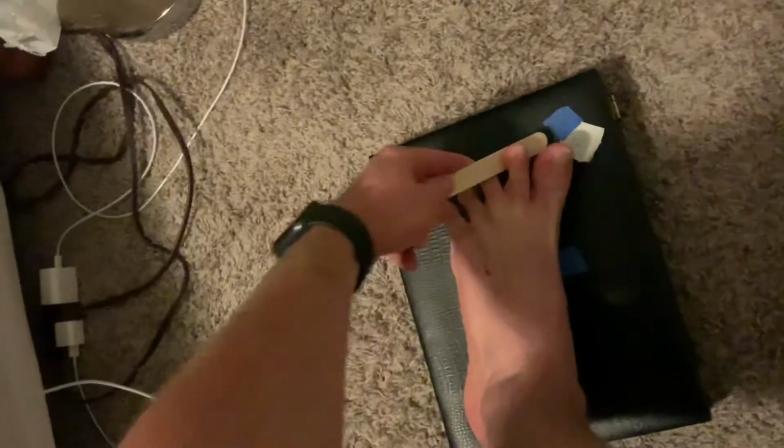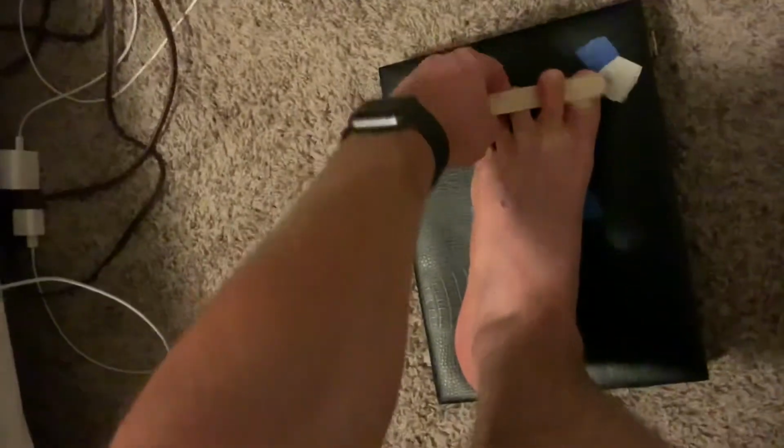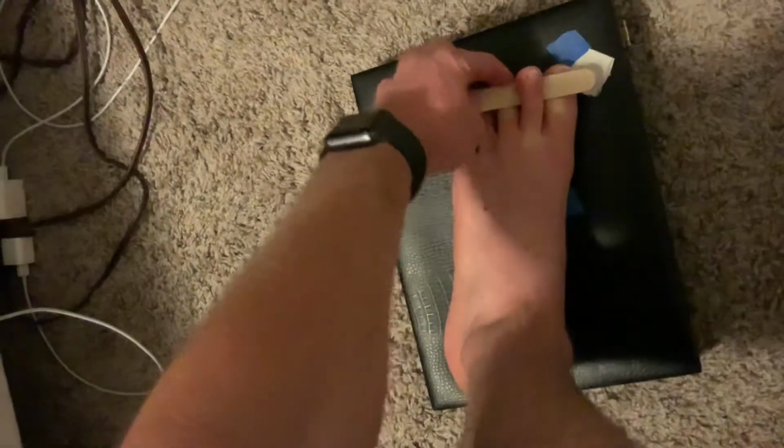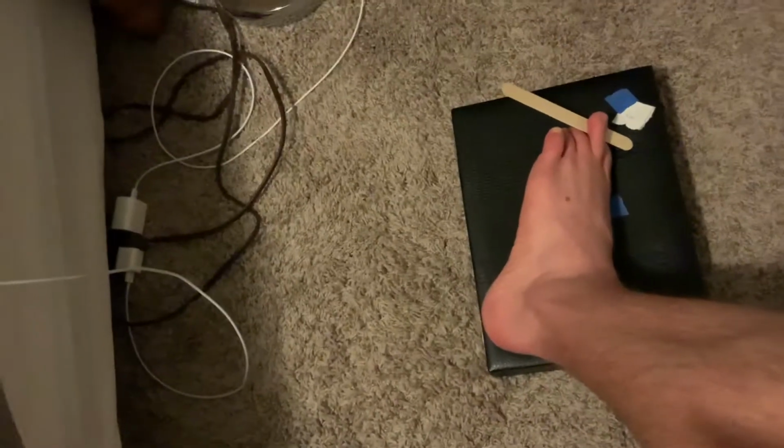The lateral toe view: we will use a wooden spatula to separate the toe that we are trying to view. And then the medial surface of the foot will be resting on the x-ray cassette.